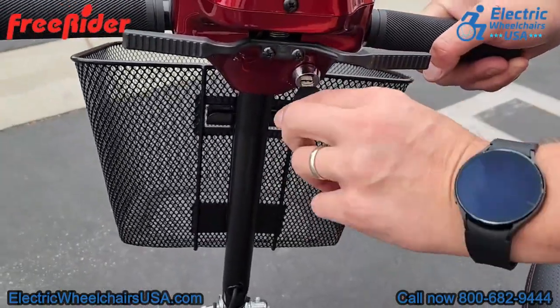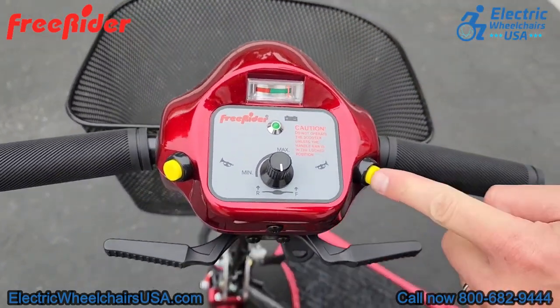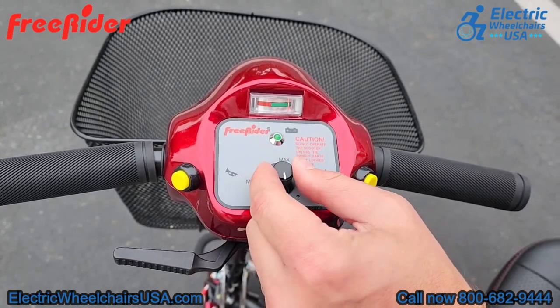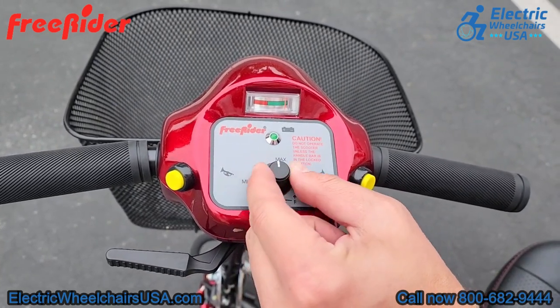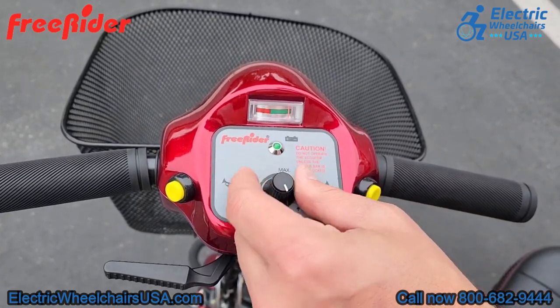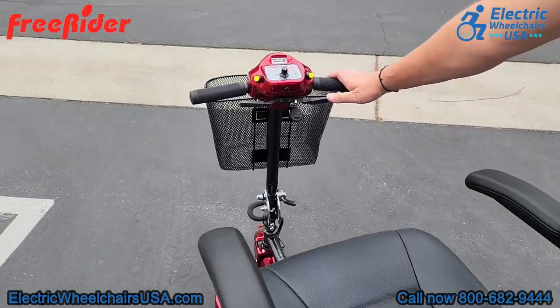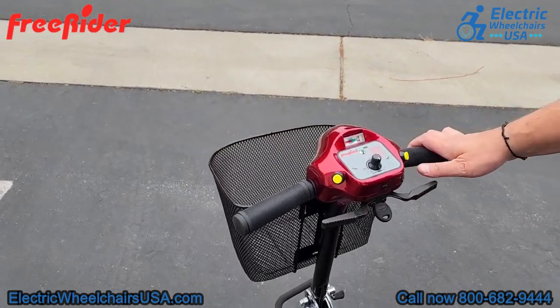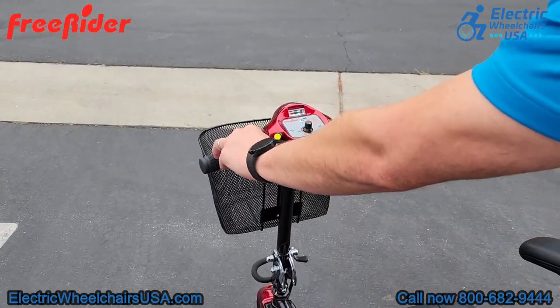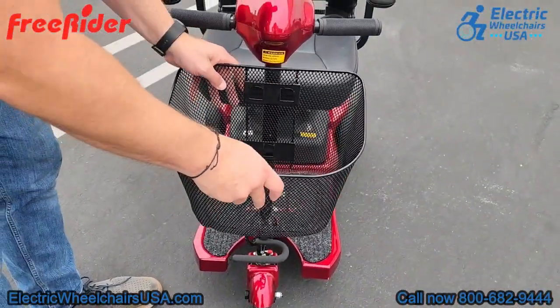On the tiller there is a key to turn it on and off, a battery gauge, and two yellow buttons that are your horn. In the middle is your speed control dial — you can adjust how fast or slow you want to go. Turned all the way to the right toward max, you can achieve a top speed of around four and a half miles per hour when you fully accelerate. The throttle is ambidextrous, so you can accelerate forward or backwards with just one hand — great if you have limited mobility in one hand.